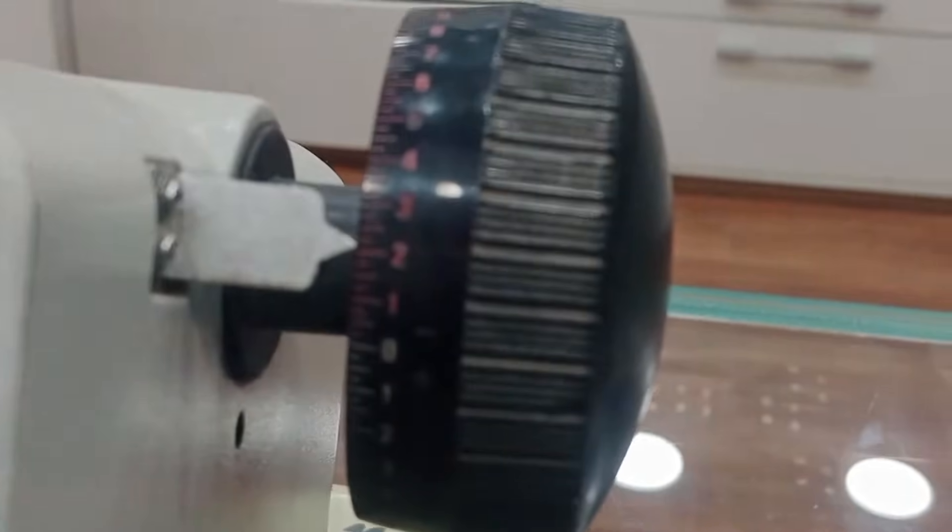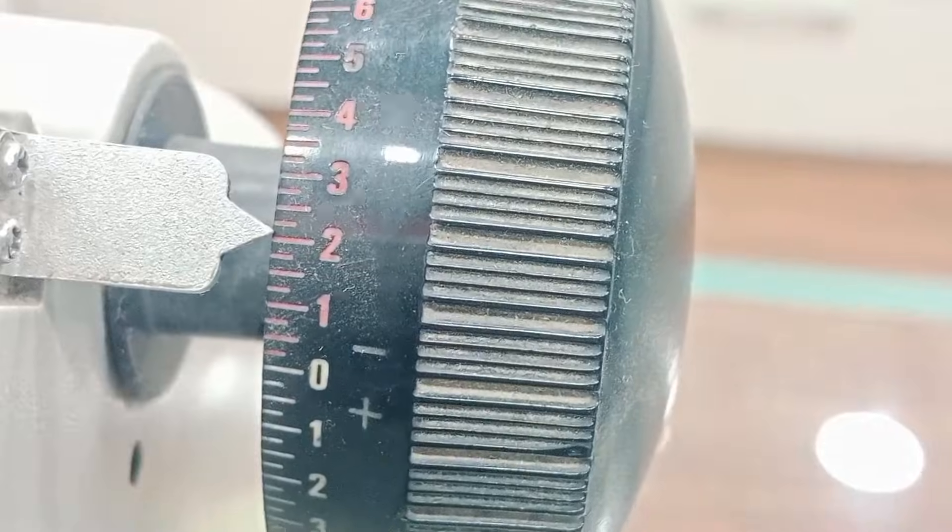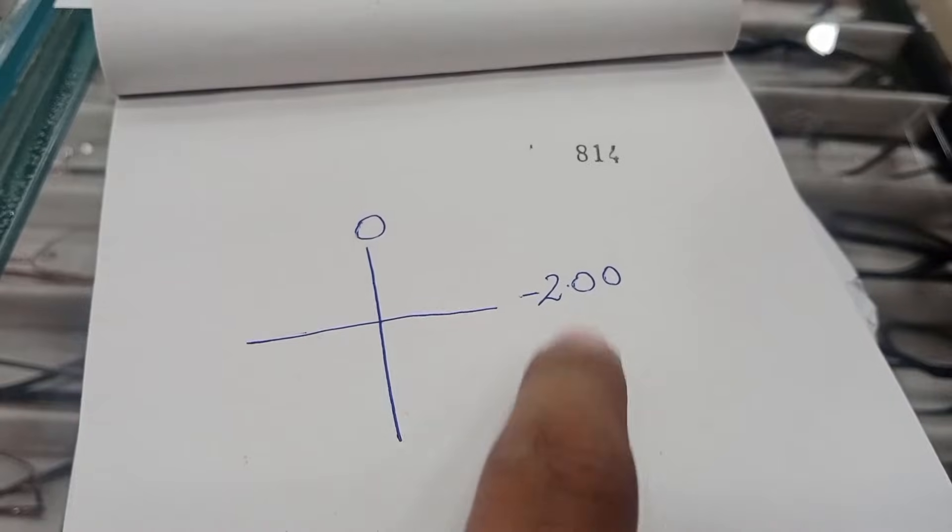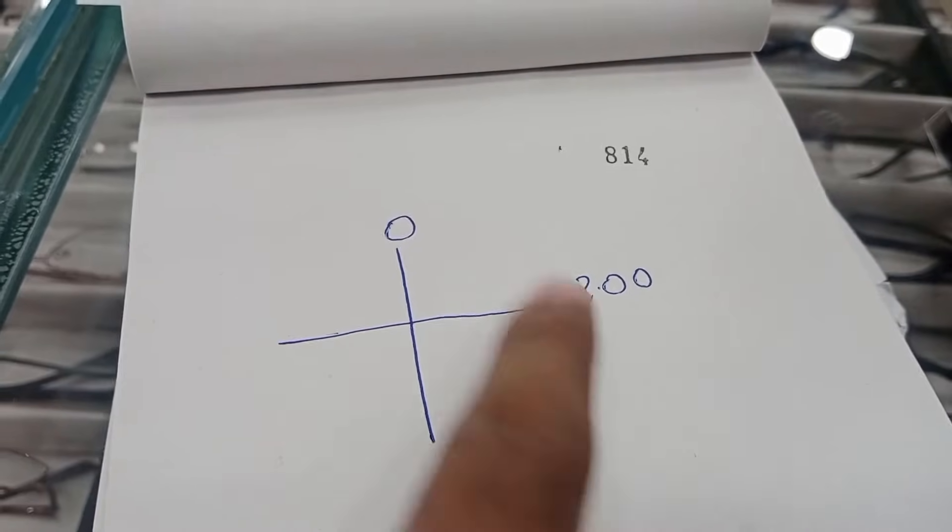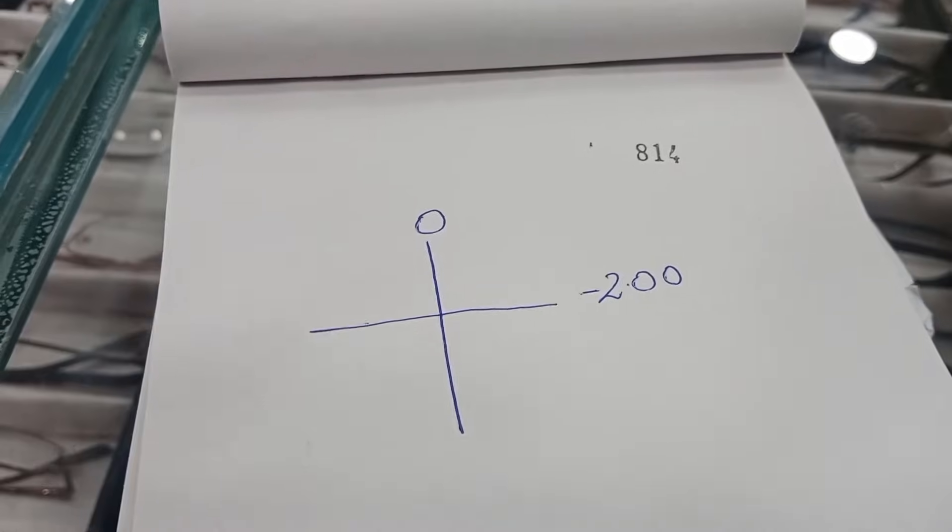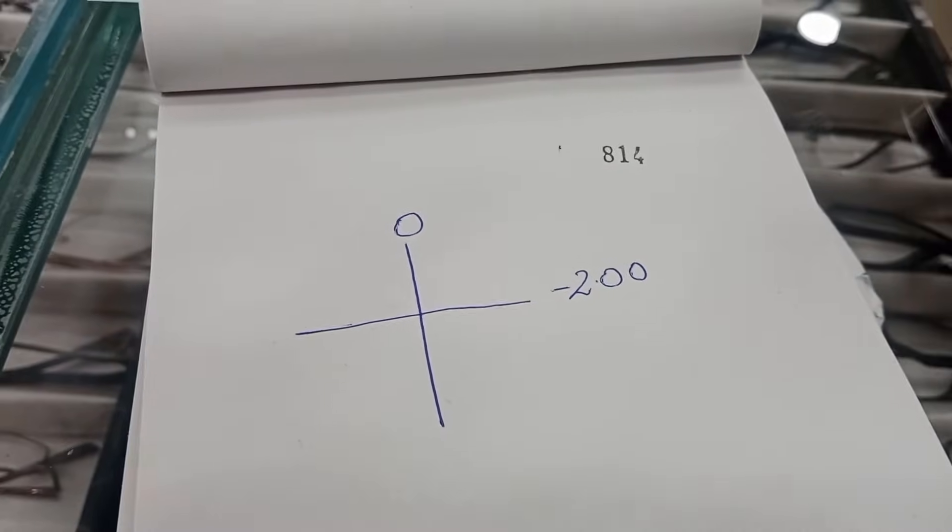And let's check the power dial. And it's clear at minus 1, minus 2.25 or minus 2. So one meridian is at zero and the other meridian is at minus 2.